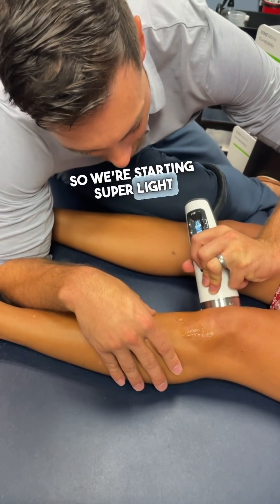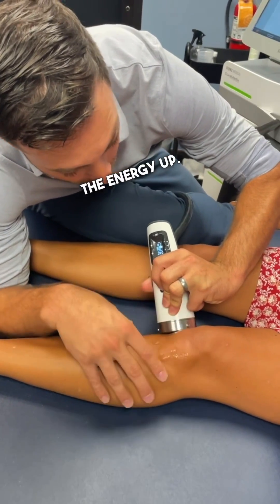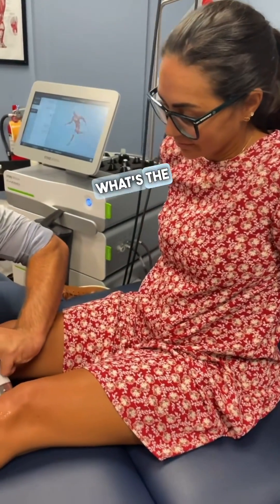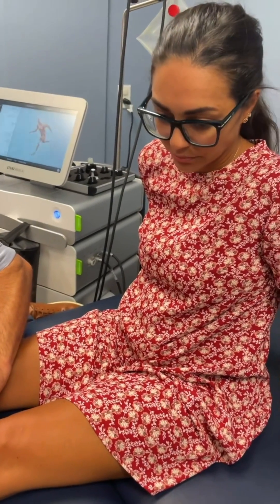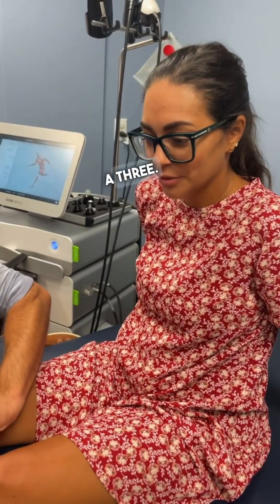We're starting super light, and then basically we can turn the energy up. Can you feel that? What's the pain level? I'm going to give it a three.